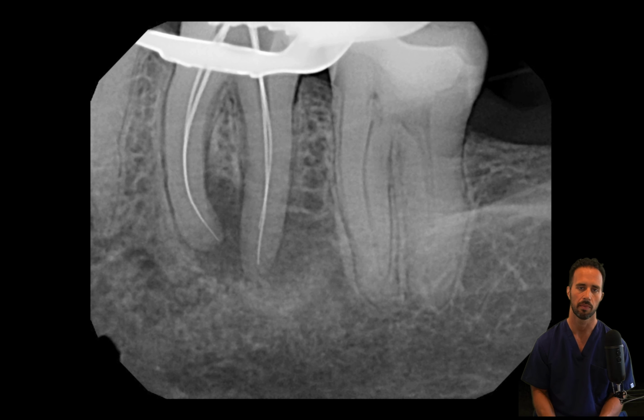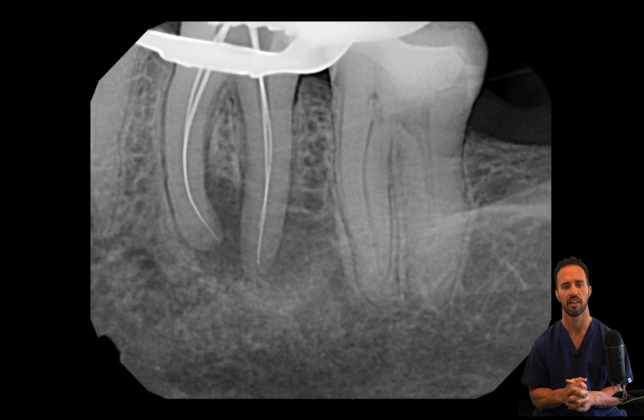These appointments we book for a half hour, but oftentimes we spend more time chit-chatting with the patient than anything else. So we're going to anesthetize the patient in the same exact fashion that we always do with our Gow-Gates injection, which is a modified mandibular block that I talk about.